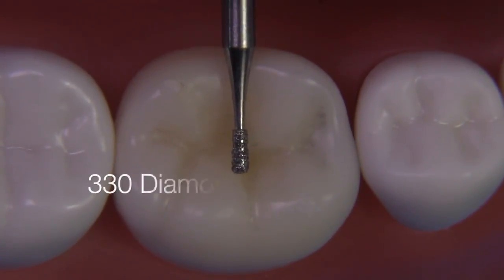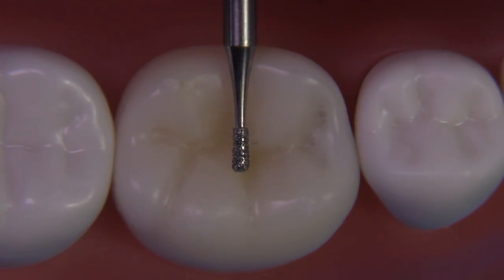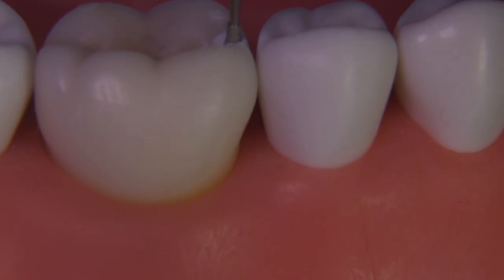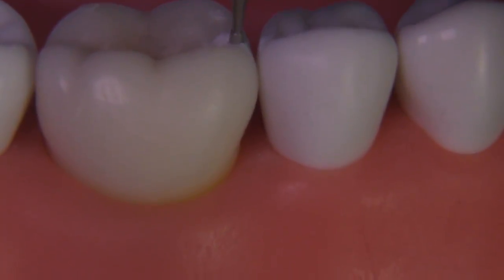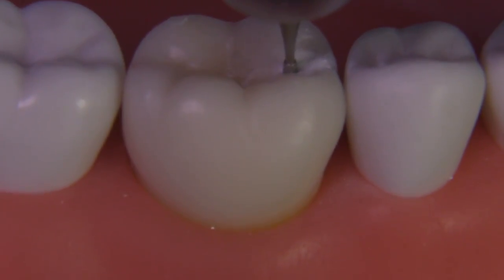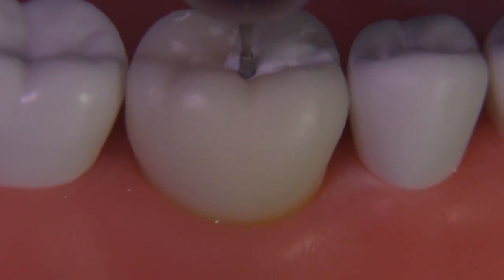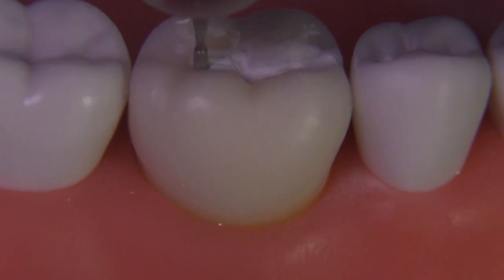I'm going to show the amalgam today because I think it's more challenging than the composite. We're going to start with a 330 diamond. The reason for choosing the diamond is that this enamel surface is very hard, and with a carbide there's a chance that you'll push it into the dentin and go too deep. But when you use the diamond, you can have a little bit more control. Always use a finger rest, of course, but the diamond will provide a better result for you.